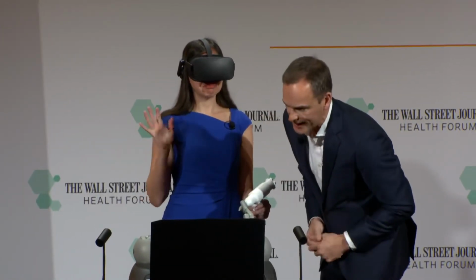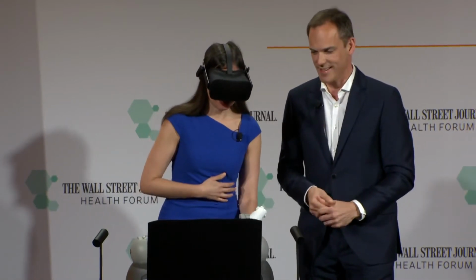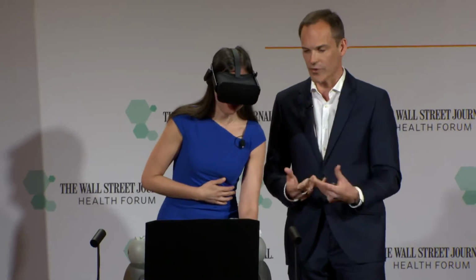44. So we forgot to take an X-ray. Should we do that? Let's have a quick X-ray. Yeah, pop it in, and let's have a look. So we use the X-ray to look at position.